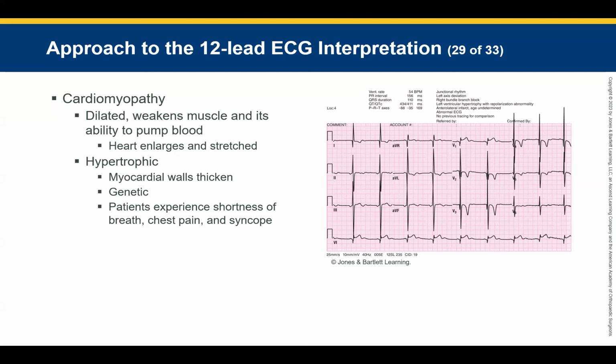How do you determine if it's right or left? I don't want you to key up on it, especially not now. I don't know that it matters to us, ever. I had to think about it before I said it, but I also know I'm being recorded. We're putting things on YouTube. Recognize hypertrophy, and that it's most likely not a STEMI.